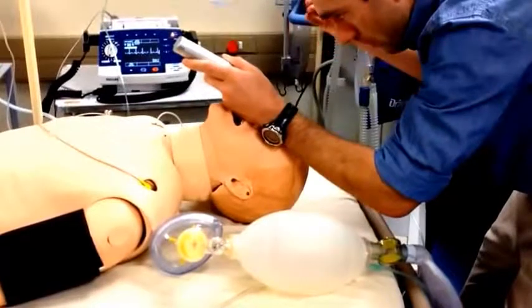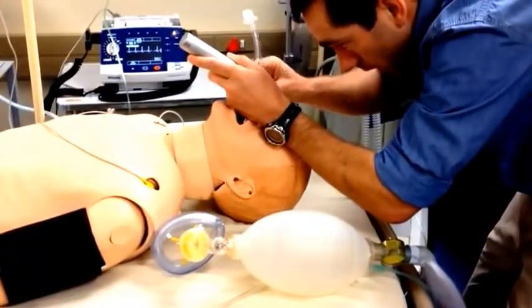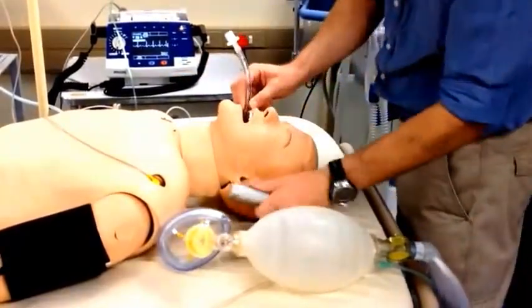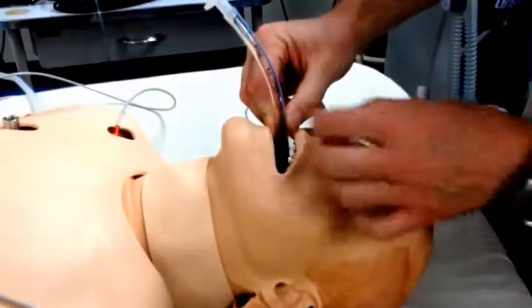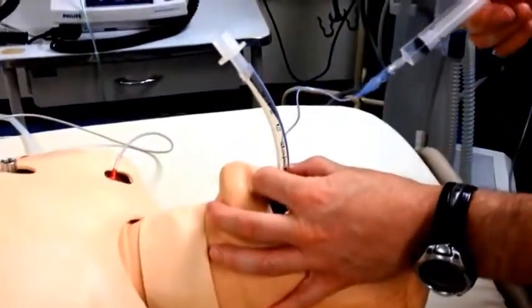Remove the ET tube from the sterile packing, advance it into the mouth and through the vocal cords, with the vocal cords lying between the tube's vocal cord markers. Remove your laryngoscope and note the depth of insertion, 22 centimeters at the front teeth in this case. Maintain control of the tube and inflate the cuff.